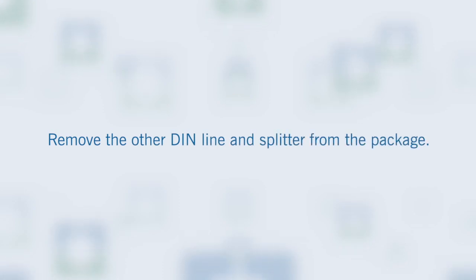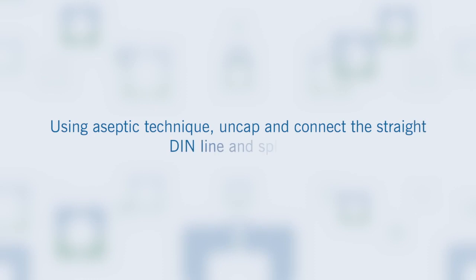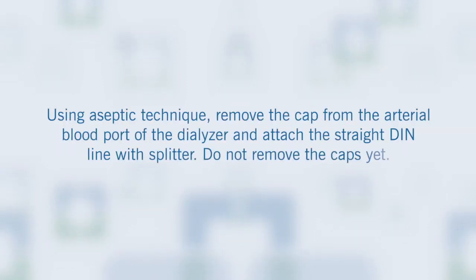Step 7: Remove the other DIN line and splitter from the package. Step 8: Using aseptic technique, uncap and connect the straight DIN line and splitter. Step 9: Using aseptic technique, remove the cap from the arterial blood port of the dialyser and attach the straight DIN line with splitter. Do not remove the caps yet.